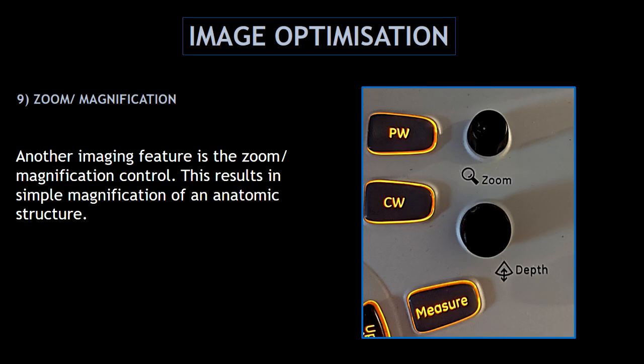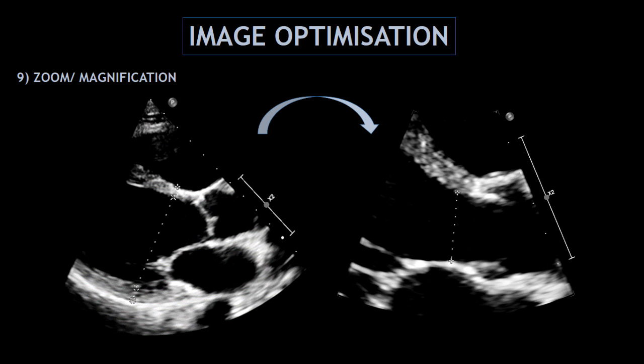Another important feature is the zoom or magnification control. This results in simple magnification of an anatomic structure. You can always find the zoom button on the keyboard of any ultrasound system. This is an example of how I use the zoom or magnification feature — from the parasternal long axis view, I'm zooming the left ventricular outflow tract to measure the diameter.